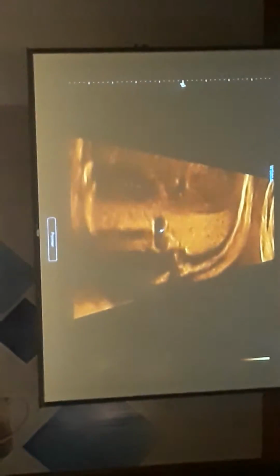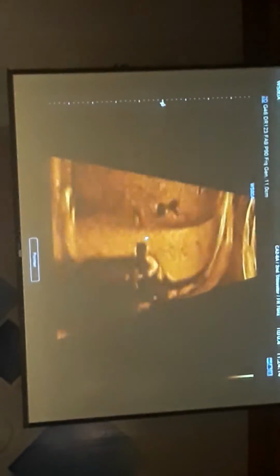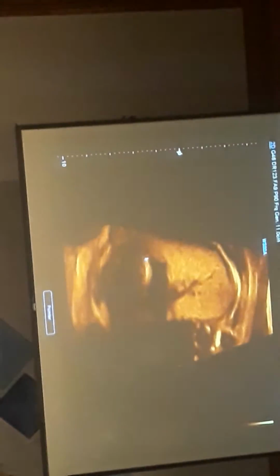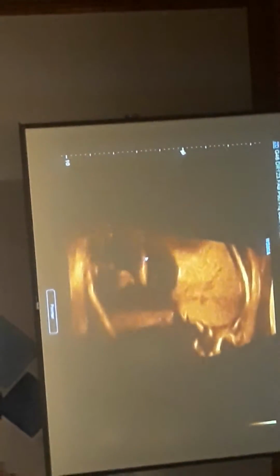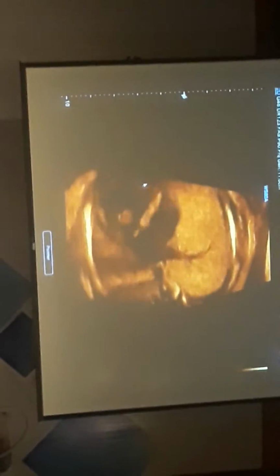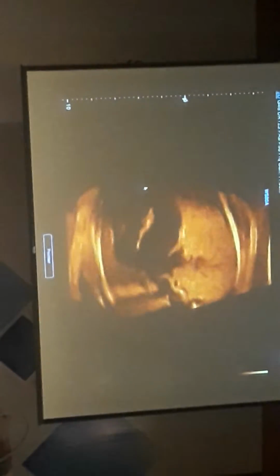And we're not seeing a big azygos here. So far, I'm not seeing any systemic vein abnormality. But I'm only seeing one inlet. It looks like this is atretic over here. So now I need the baby to be in a better position. So what I'm going to have her do is move onto her left side.